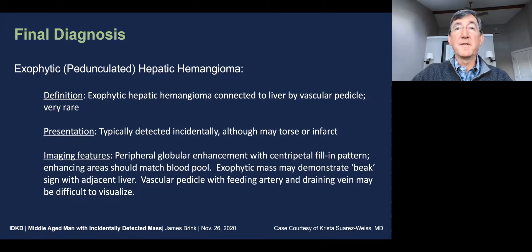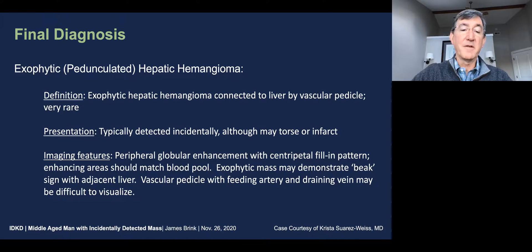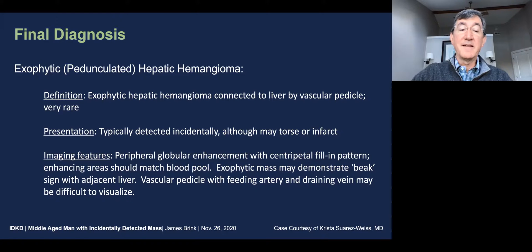Imaging features include typical findings of a hemangioma, including peripheral globular enhancement with centripetal fill-in, and the enhancing areas should match the blood pool.